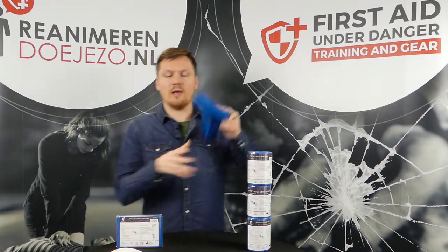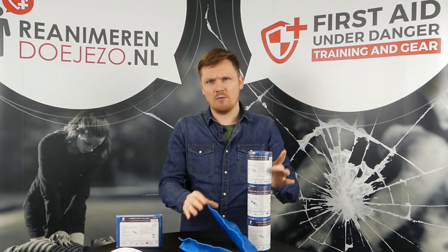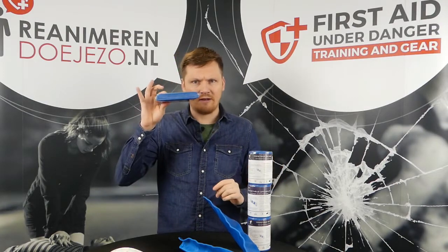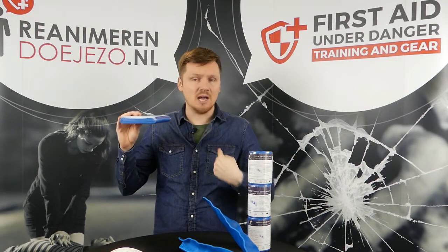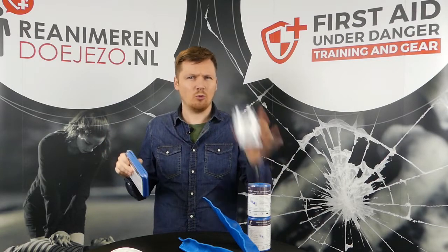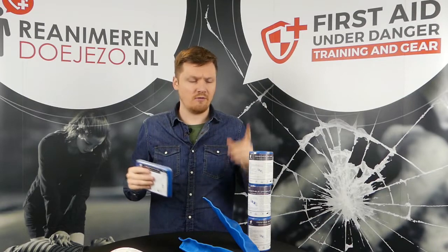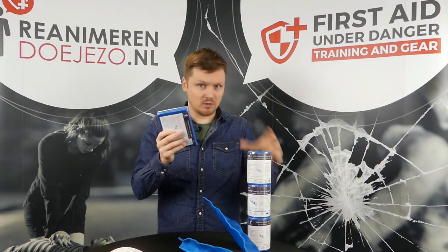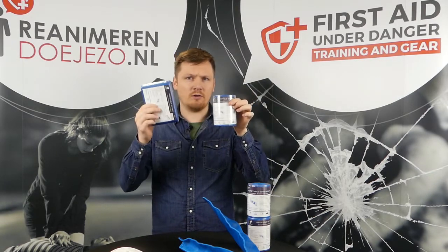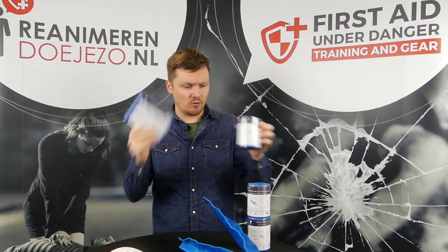If I roll it all the way out, this is about 91 centimeters. We have it in a rolled-up version and in a flat version. The flat version would be my own choice — it's better to keep it within a bag than the rolled-up version, though for some people the rolled-up version is fine. It's the same length either way.